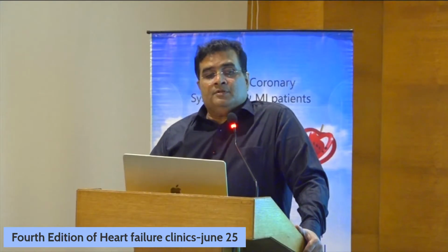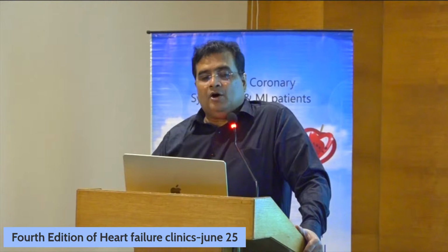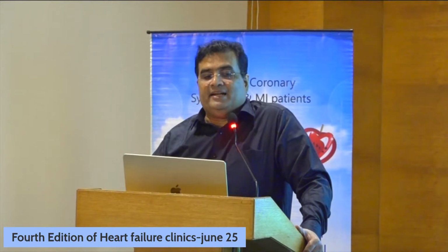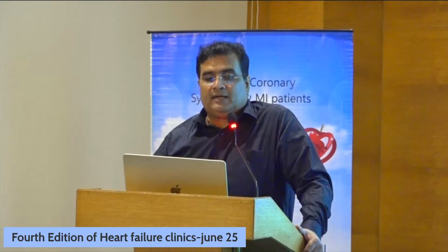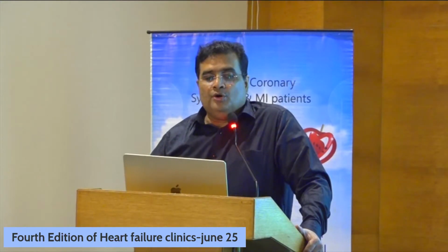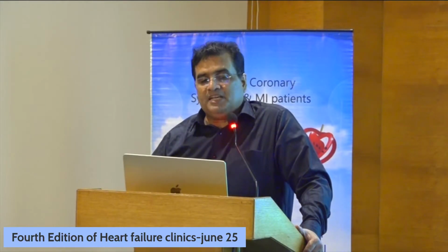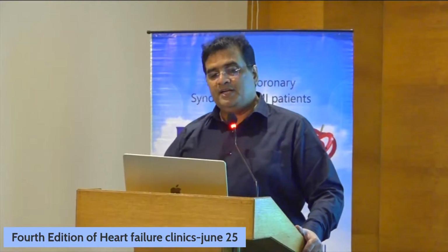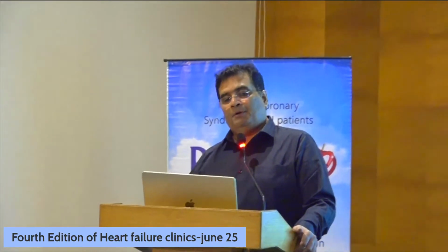Now, if you can see the orange one, this is the rest perfusion scan. You can see that the perfusion is good, and here the metabolism is also good. So both perfusion and metabolism are in the same color. That indicates there is a viable myocardium and there is no ischemia. So that means there is no muscle damage for this patient. When perfusion and metabolism are both matched, it indicates a viable myocardium.